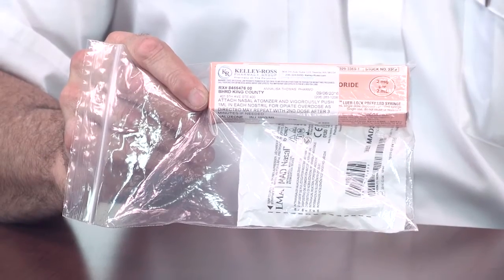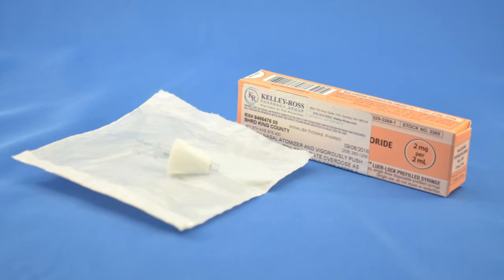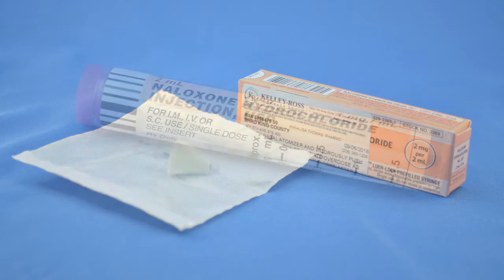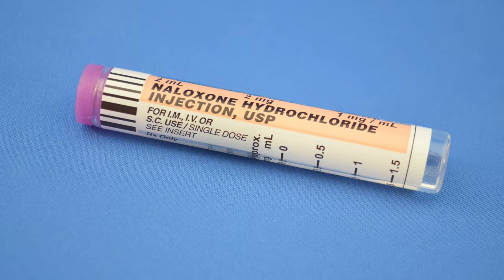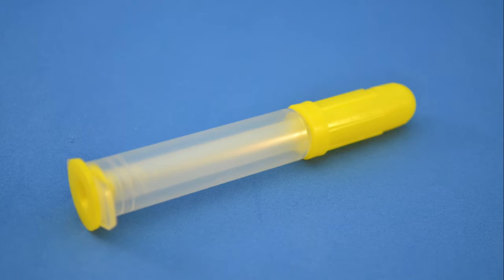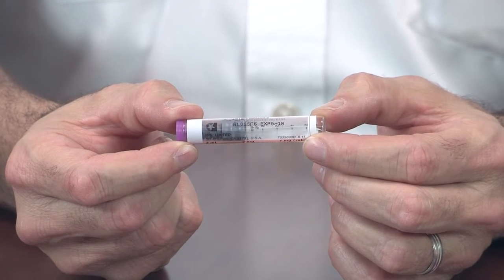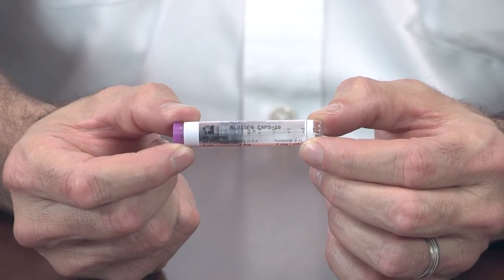Each intranasal Narcan package should contain one box of nasal Narcan and one package containing the MAD device. When you open the box of Narcan, you're going to find two pieces: the glass vial containing the Narcan and a plastic barrel syringe. Make sure that you check the expiration date on the glass vial and check the contents of the medication to ensure that it's not cloudy or discolored.